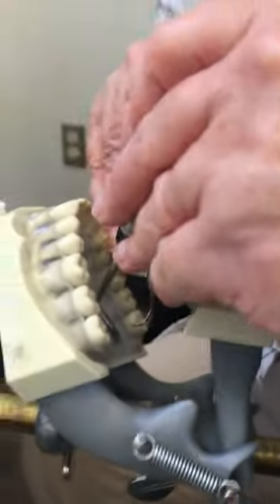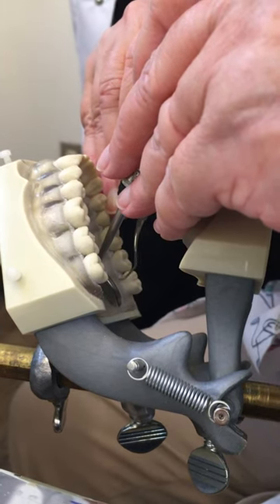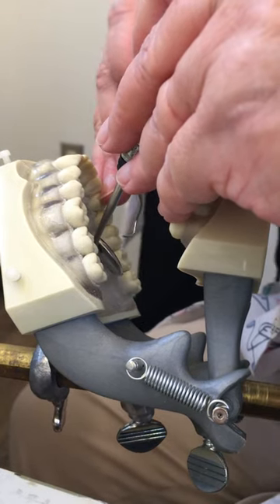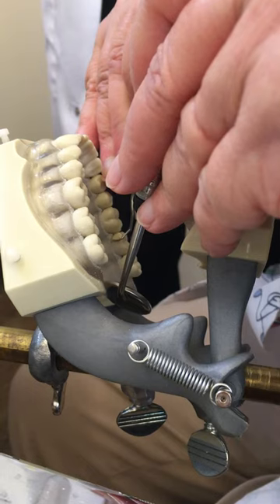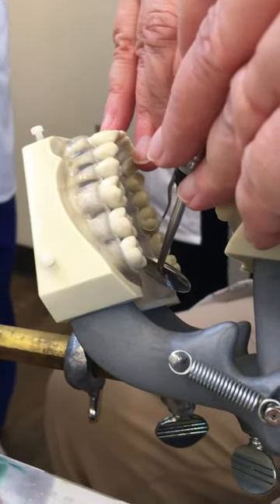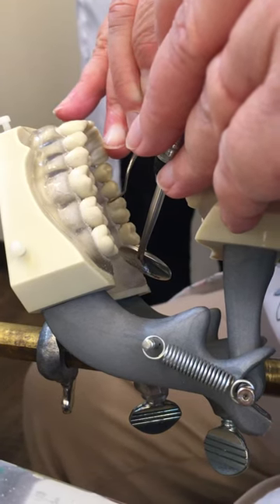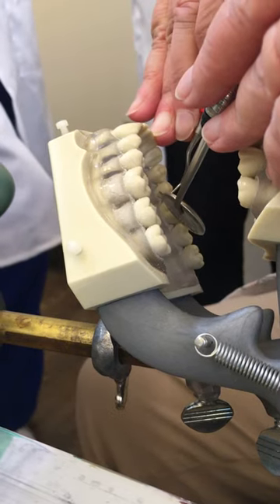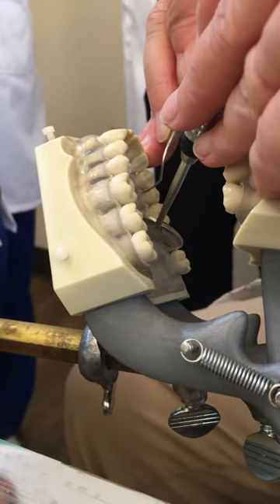For area 6, I'm going to come back over. I'm going to start at the distal line angle. I know I've got the right end because I had the right end in area 5 — it's a mirror image. And remember that your fulcrum is unstable in this area, and you would be using your mirror for indirect vision.